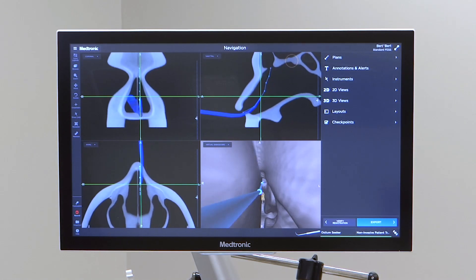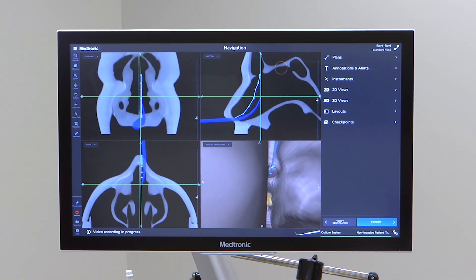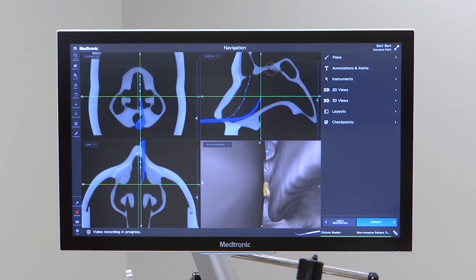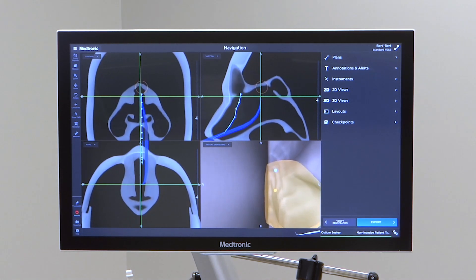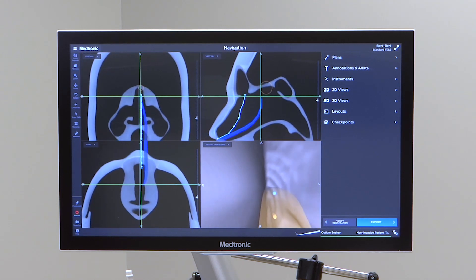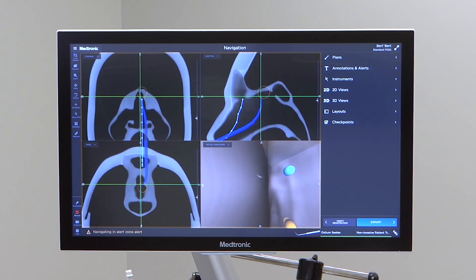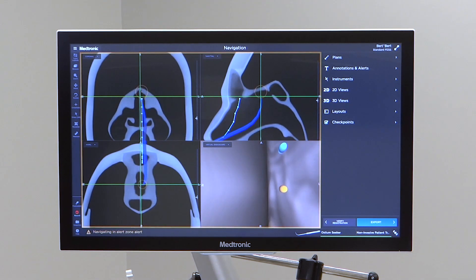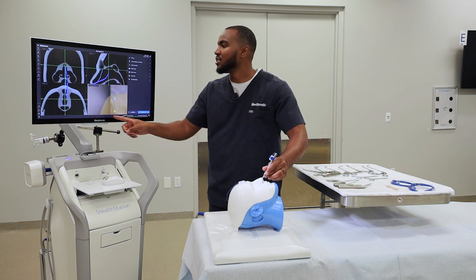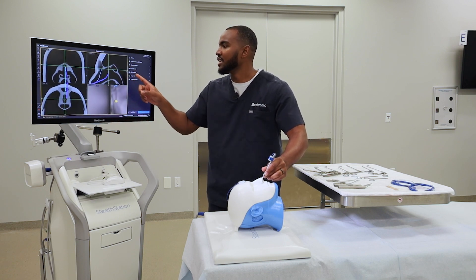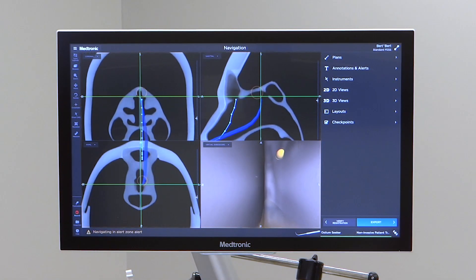The plan is following one plane, as I mentioned, all the way up into the frontal sinus. You see the different waypoints. Now I'll get into the alert — you see it notifies you as soon as you're nearing a critical structure. The outer box of the screen is blinking yellow, and you also hear an audible noise as well.